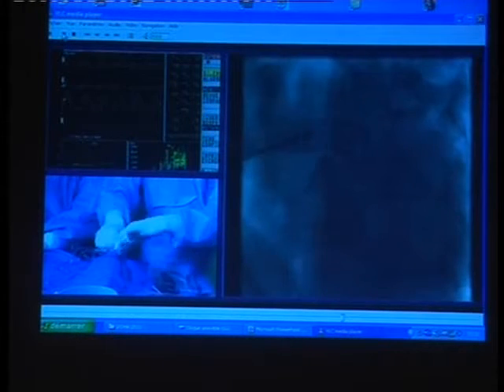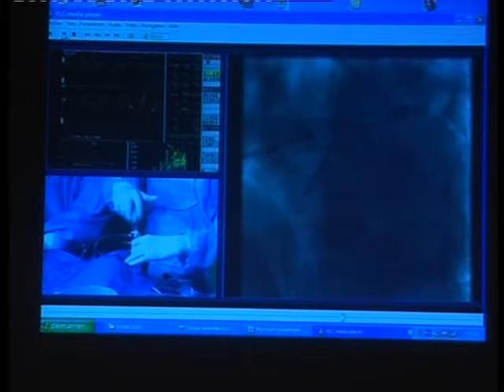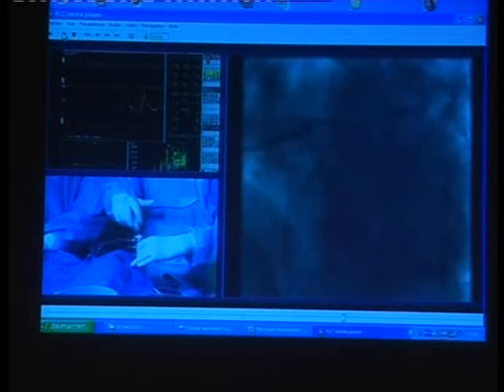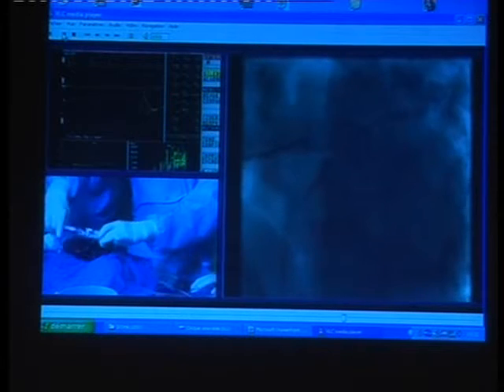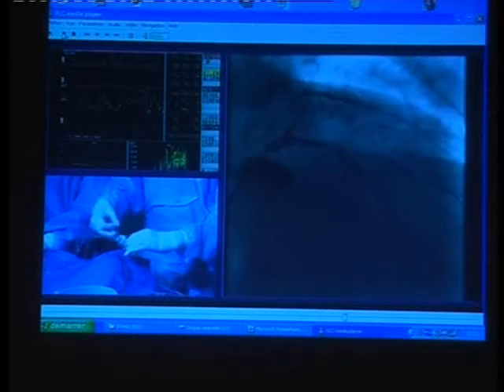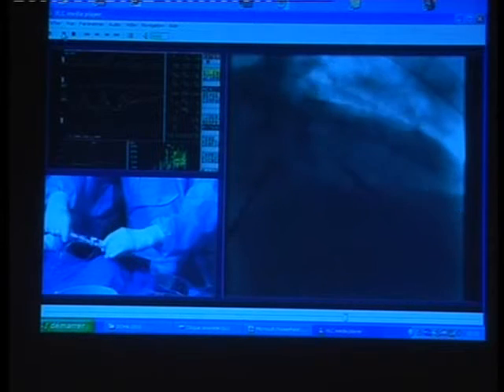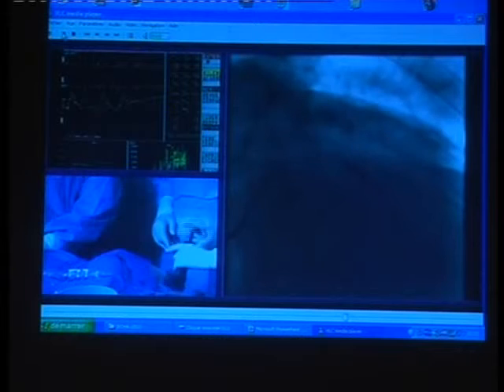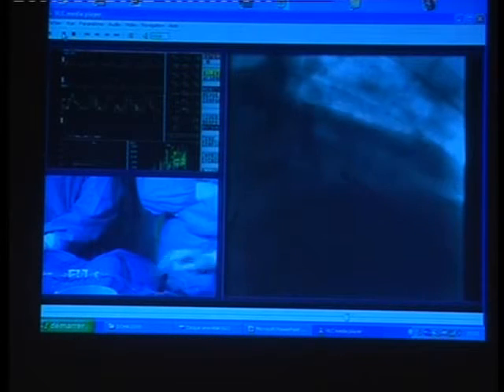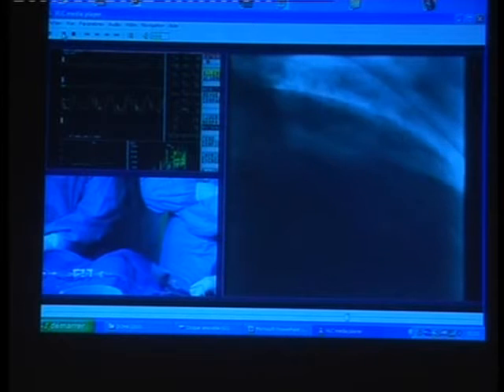What you can do is an angio during the balloon inflation to see the diagonal. I think it's perfect. It seems to be good. We see the position is very good. Do you inject during inflation to see where the side branch is? Yeah, it's just to confirm that we are just after the right marker position. If it is not the right position, it's too late.